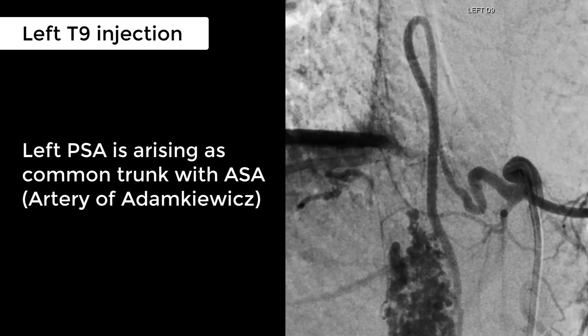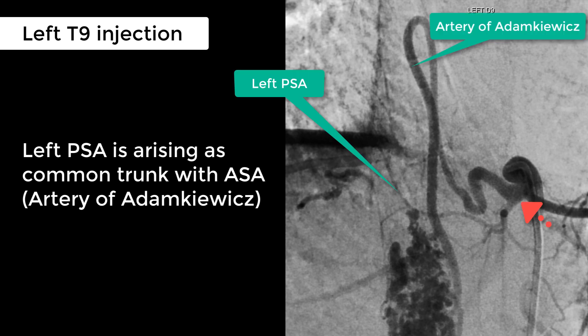Left T9 intercostal injection also showed origin of the left posterior spinal artery arising as a common trunk from the artery of Adamkiewicz. The left posterior spinal artery, however, is not supplying the AVM.